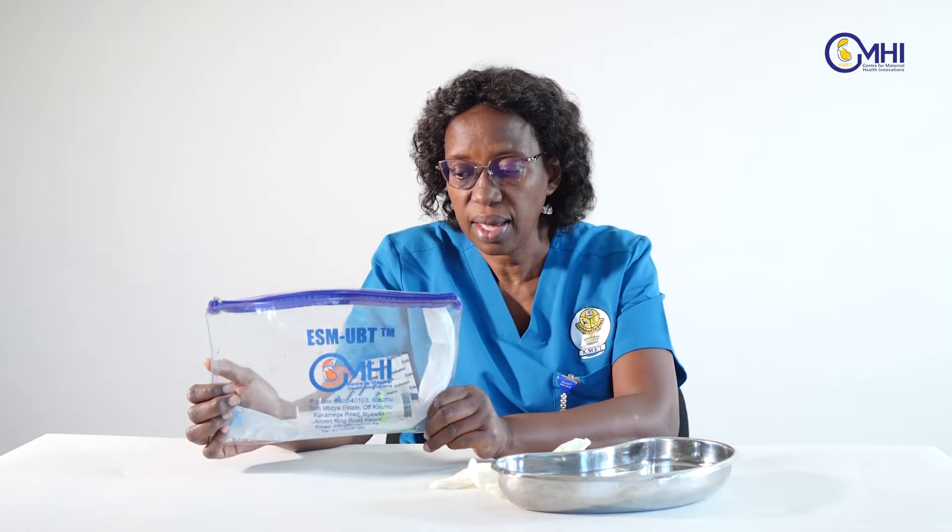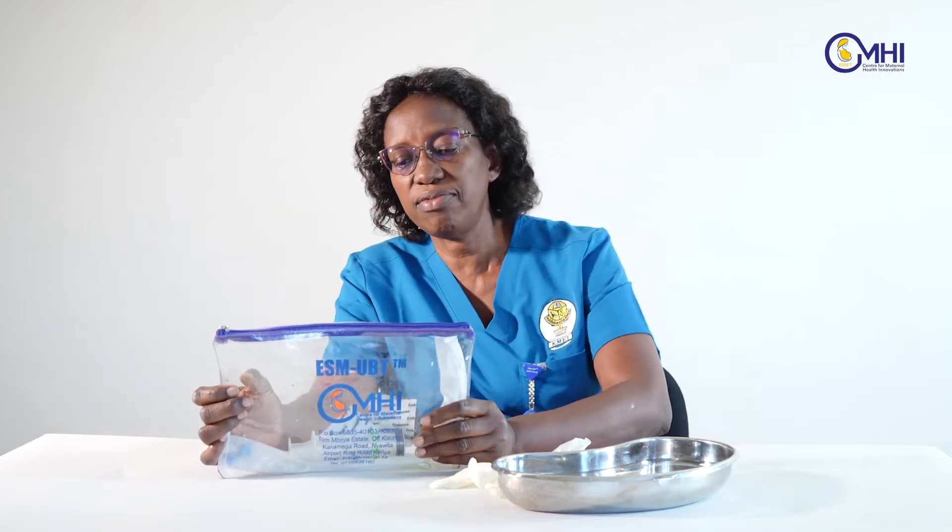This is a uterine balloon tamponade — the Every Second Matters uterine balloon tamponade. The tamponade is used when we have uncontrolled bleeding after delivery and the mother needs help. I'll briefly show you how to assemble it.